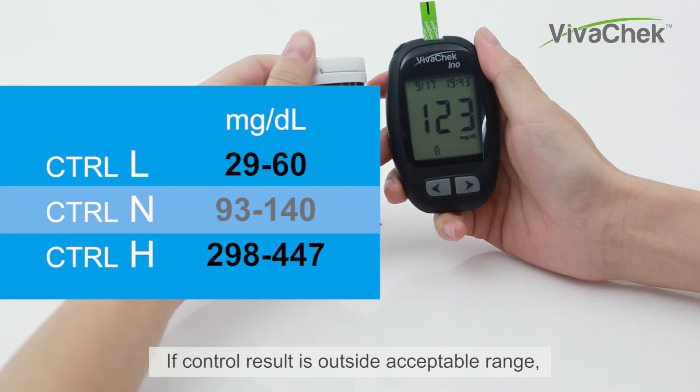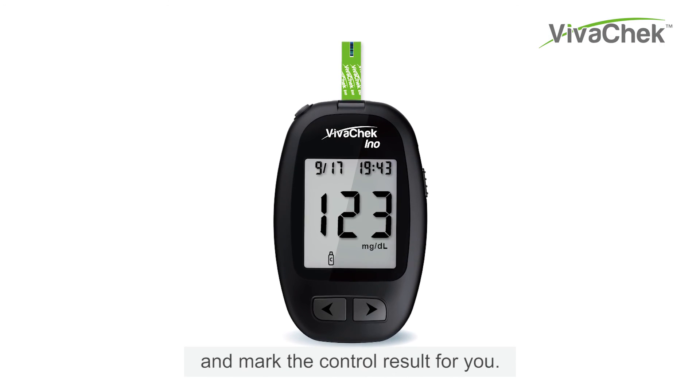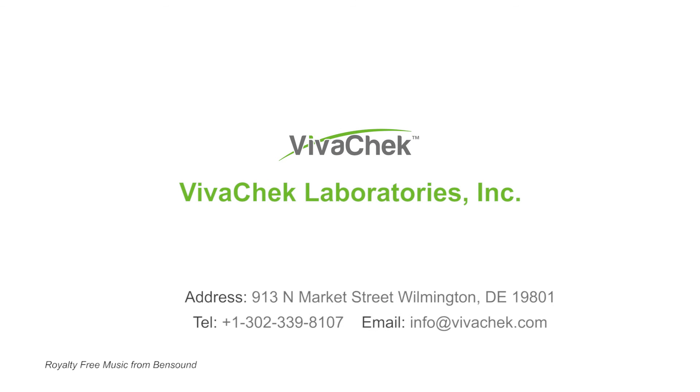Make sure the control result falls inside the range of the corresponding control solution level you use. If the control result is outside the acceptable range, refer to the user's manual or contact your VivoCheck local dealer. The meter will automatically recognize and mark the control result for you. Control results are not included in the average calculation. Thanks again for choosing VivoCheck Inno Blood Glucose Monitoring System.